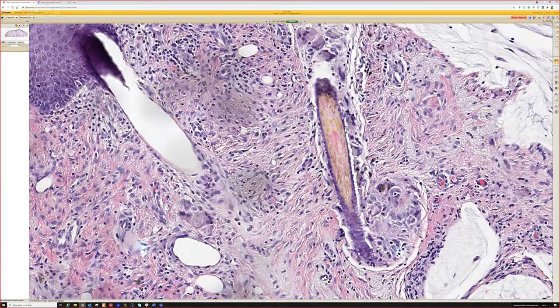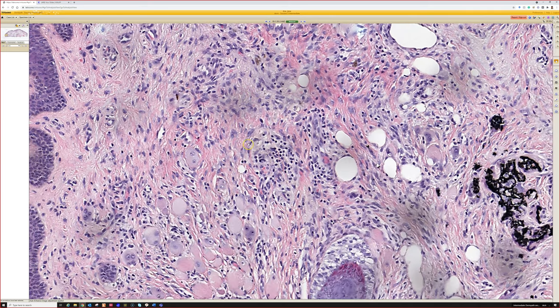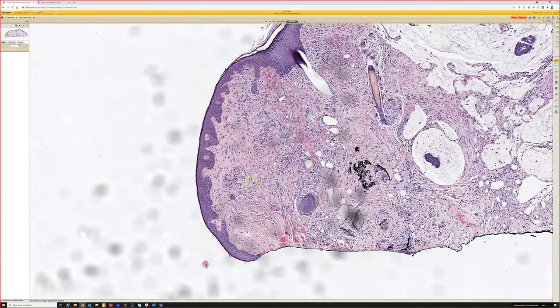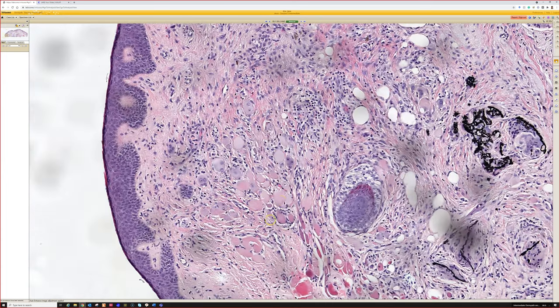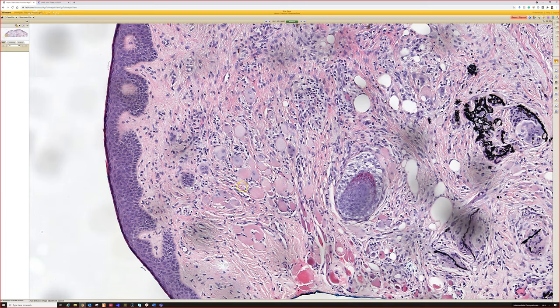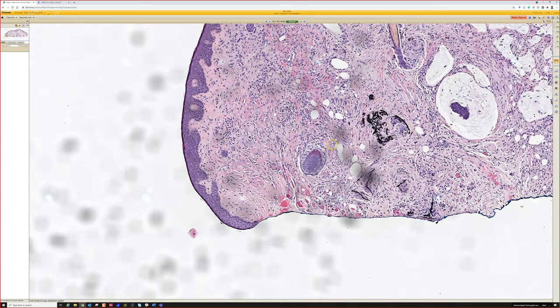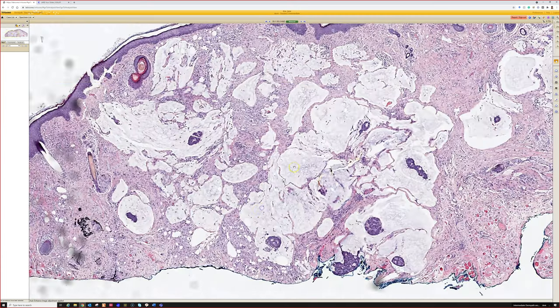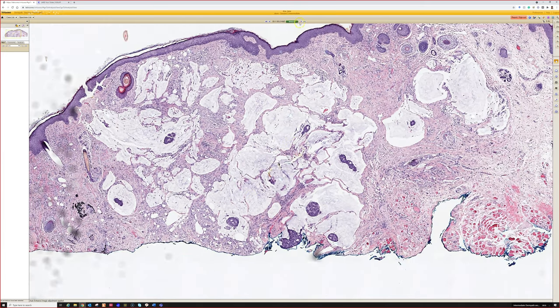See, because we had hair follicle rupture here, probably somehow related to the tumor, or maybe, you know what? I bet they may have biopsied it before. I don't know. But here is a ruptured follicle, and as a side effect of that, we are getting atrophic and reactive atypia in the skeletal muscle, which can look really bizarre. Always good to pay attention to that. So there, mucinous carcinoma of the eyelid.